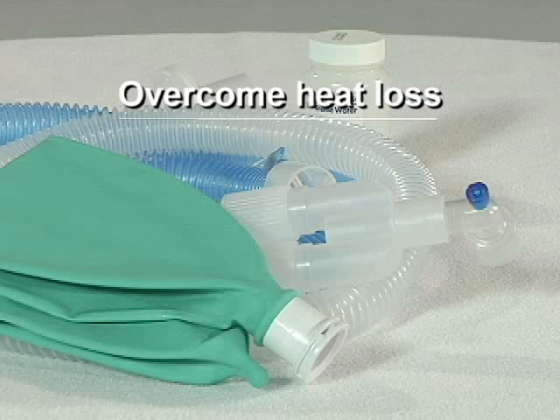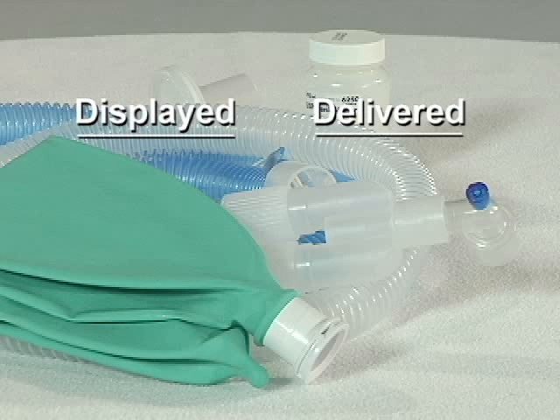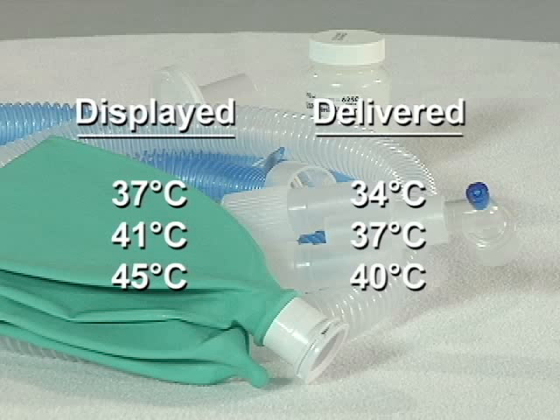You may also need to compensate for very cold room temperatures and/or low air flows. Testing shows the following typical temperature drops between wick circuit output and ET tube. Treatment presets setup: 40 degrees centigrade.